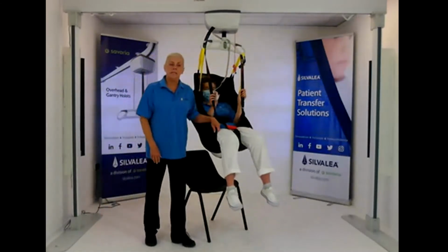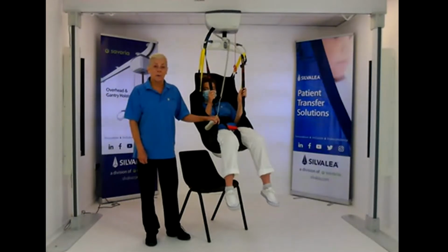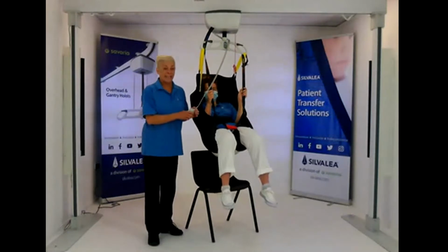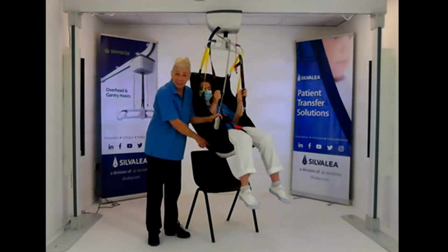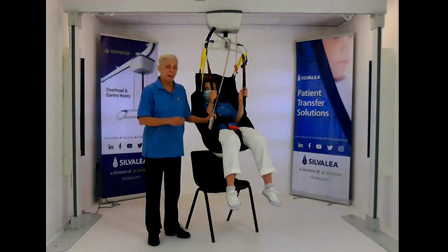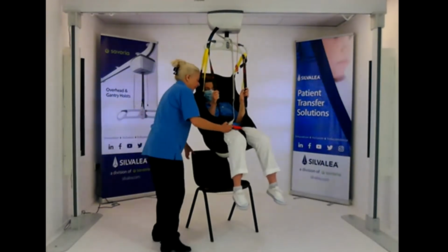Leaving slings in, of course, has to be determined on the individual assessments and working out what the best practice is. It's all about balance, care and working out whether the sling is better being left in. Are there going to be problems in getting the sling in and out, or is it best to leave it in situ? So it's working it out. We can help you with choices, styles. You've got to factor in, you're going to have an aperture here. Is there any risk of the binding? So you just need to think about all the different options, but certainly we can help you with that. So let me just take Laura down a little bit.